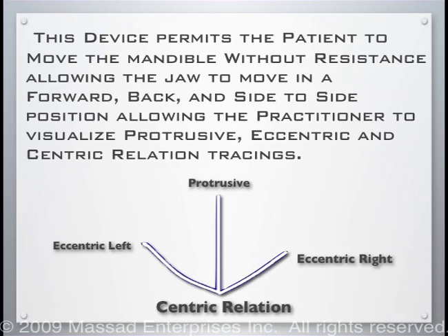The patient is not manipulated. The patient is asked to freely move their jaw forward and then back. It is suggested that we inform the patient to slide or rub as opposed to move for a better understanding. The patient should close to allow the pen to touch the striking plate while sliding in all required positions. They are asked to repeat this several times to be assured that there is a smooth, repeatable tracing.